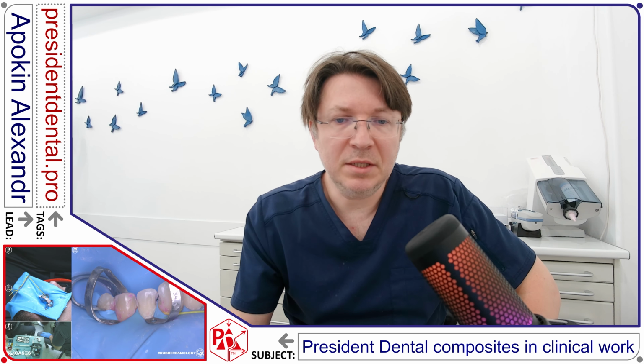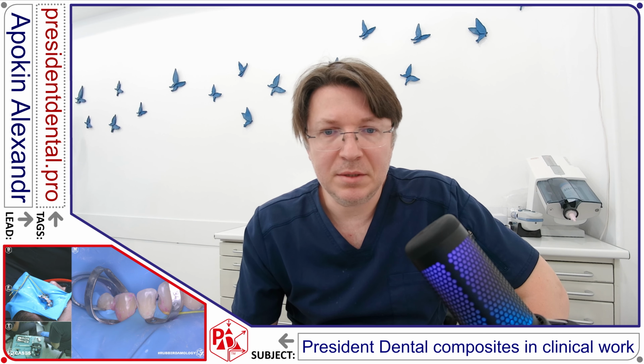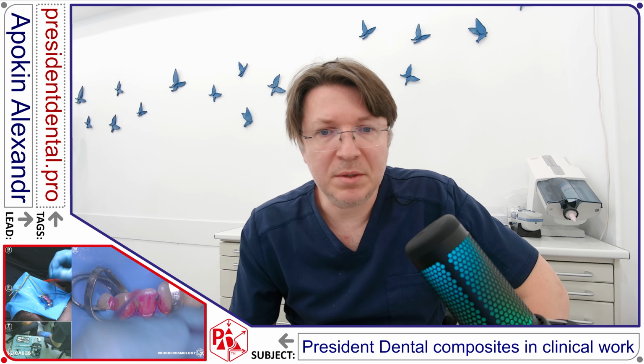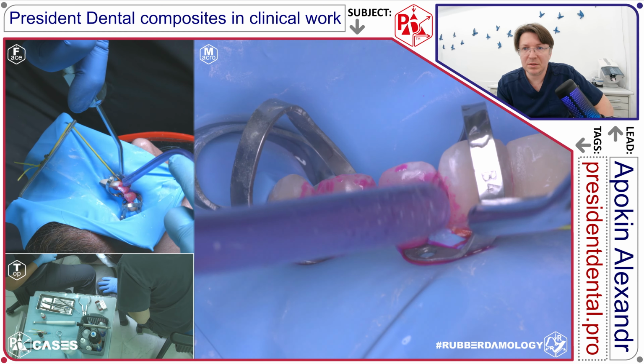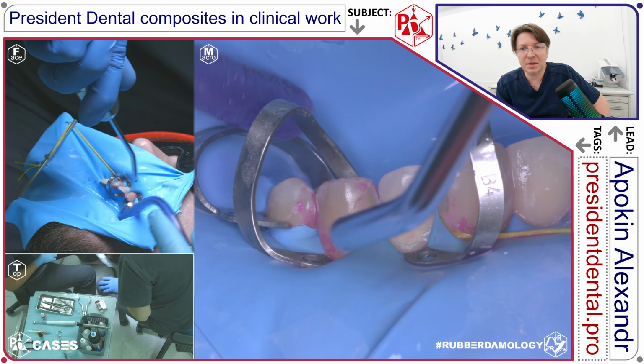Some information about our clinical materials. I made clinical recordings with a special technique, and this year I'm working with 3 cameras. One of them is the main macro camera, which I use like a microscope, and mark it with the hexagon macro at the center of this clinical video.